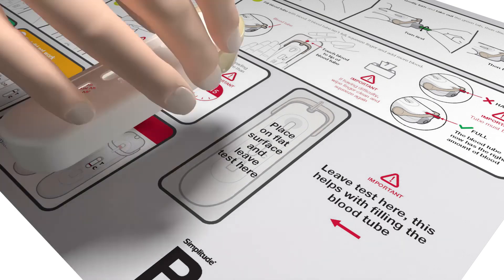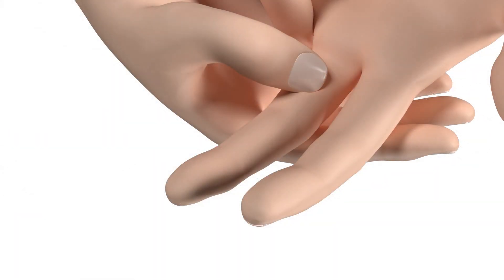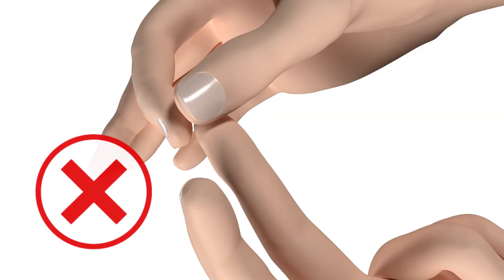Then place your test in the space shown on the instruction sheet. To get a droplet of blood, massage from the base of the finger up just behind the prick site. Do not pinch your finger in front or to the side of the prick site as this will reduce blood flow.